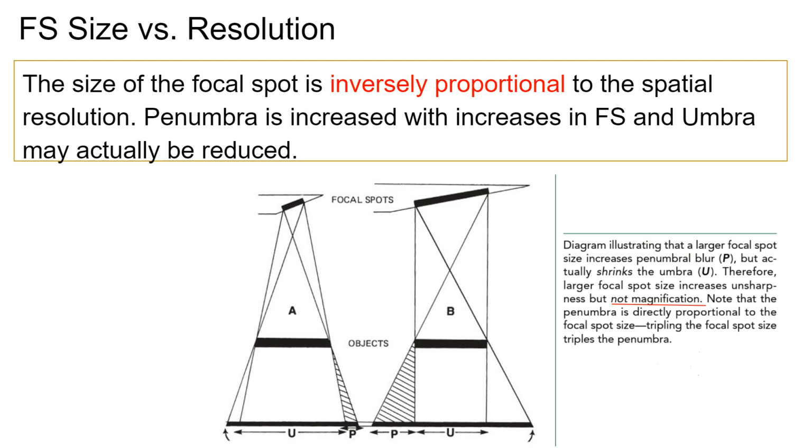So here, all this is penumbra. Now let's say this is a large focal spot. We're going to go to a small focal spot, right?